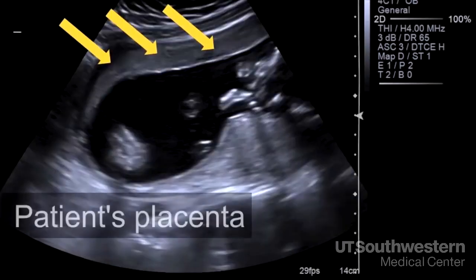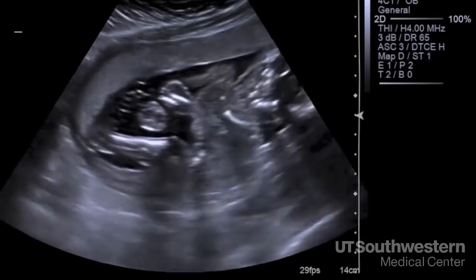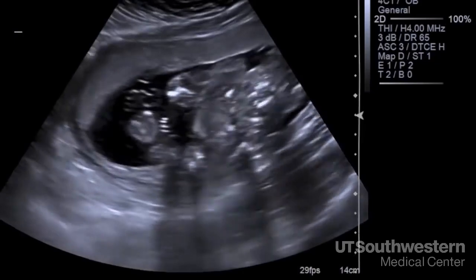The placenta is on the front side of the uterus. We want to look at that location relative to the cervix. But this early in pregnancy, even if it is low, there's a good chance it'll move higher later in pregnancy.